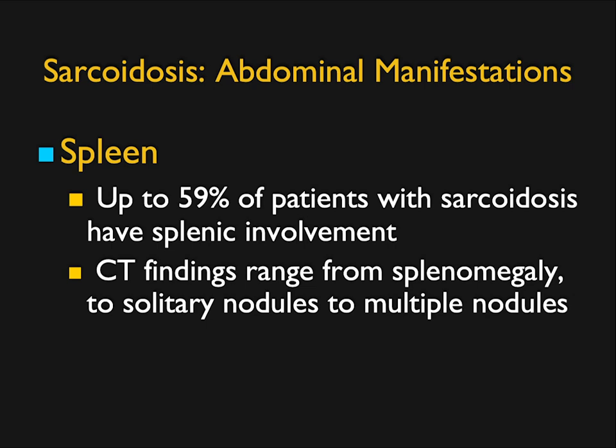So again, when you see lots of splenic lesions, you want to be thinking about sarcoid. Sometimes you don't know that the patient has sarcoid, and they don't know they have sarcoid. Look at the chest. It makes it easy.